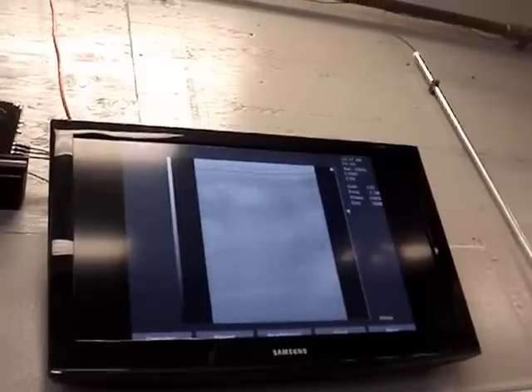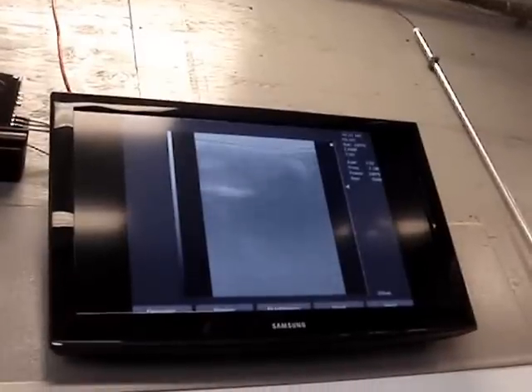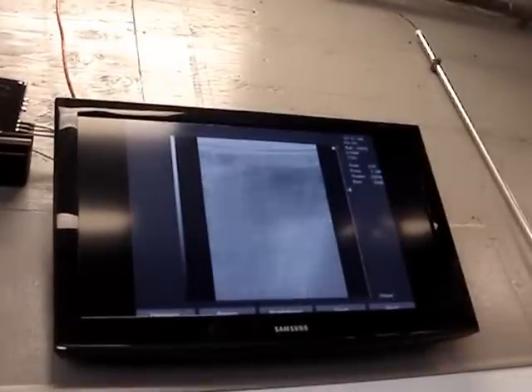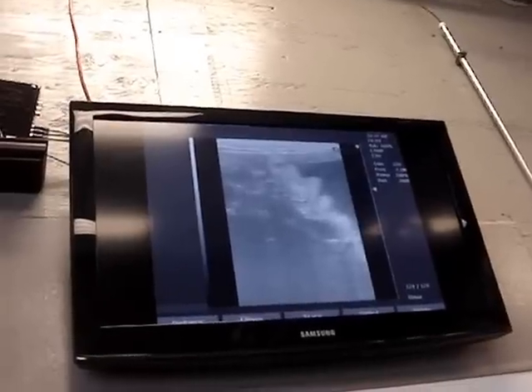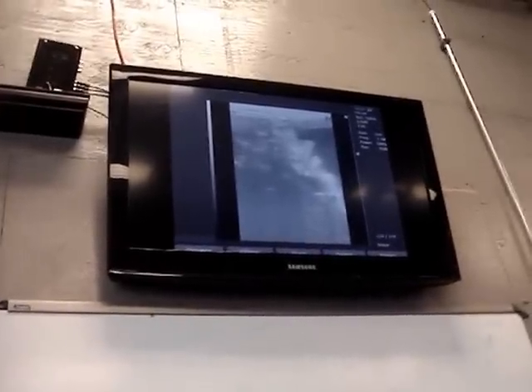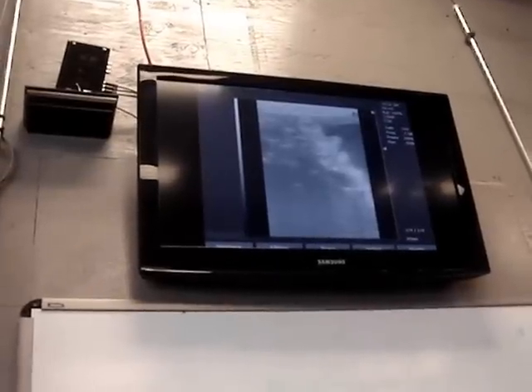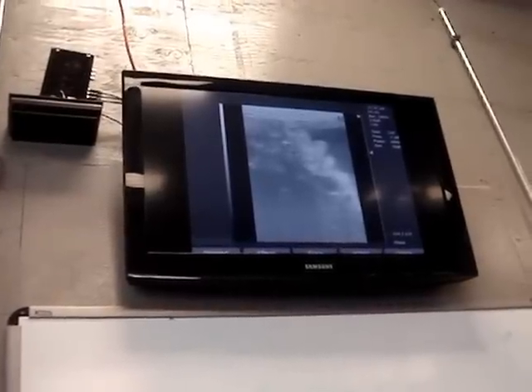This is all part of her uterus here. Bouncing him along, he or she, I keep calling him him, but we don't know what it is yet. There we go. All right, so this is actually a decent picture right here. While we're waiting for baby to kind of jump up and down, this area right here is what we call the combined utero-placental unit. So it's where the placenta has attached to mom's uterus. We'll look at that and measure that as an evaluation of how the health of that baby's doing, the placenta itself. And it's kind of hard to see, but you can see this little white line right here. That's actually the amniotic sac, the little white sac that the baby's enclosed in.